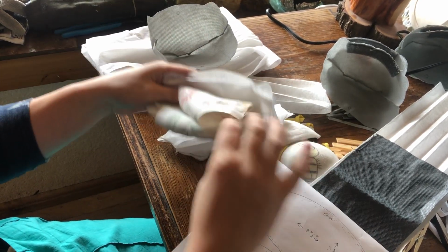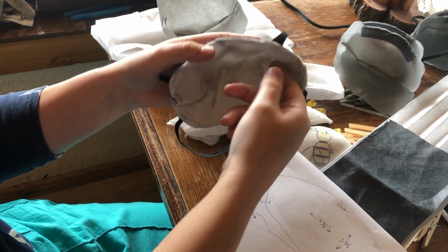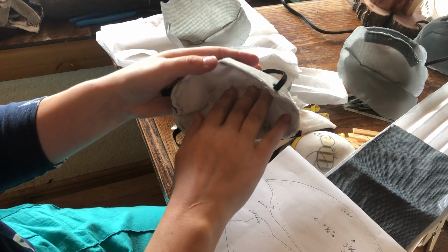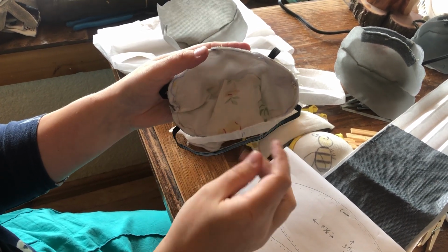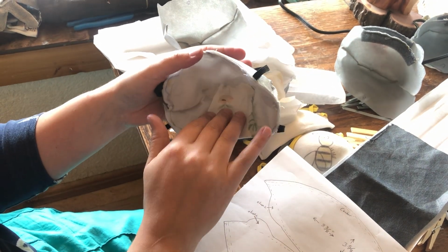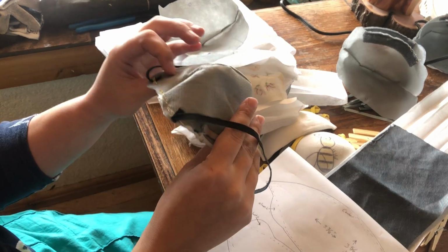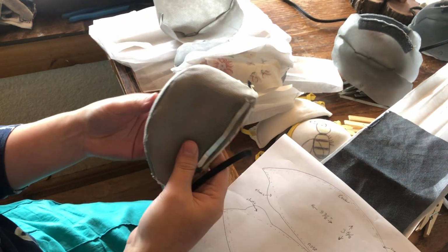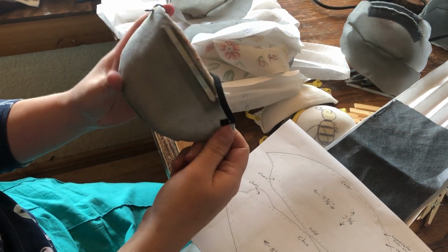You're going to fold the edges of it in a little bit so it doesn't unravel as bad, and then once again I just tacked it in with hot glue. It's not going to fall out. You don't want it to fall out, because then someone will be trying to do something and their thing is slapping in their face, and then they're going to have to touch their face and stuff like that, which we're trying not to do. Alright, so after I sewed all that together, I trimmed up the edges around the edges.